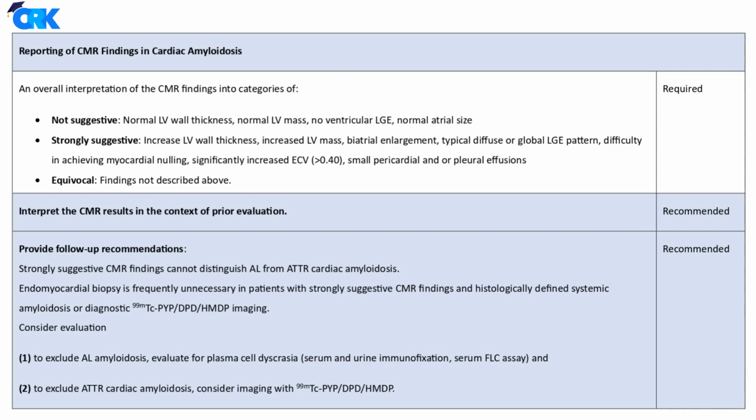Equivocal. This category is for studies that don't clearly fit into either of the above. Findings may be borderline, mixed, or atypical. In such cases, additional testing or correlation with clinical and laboratory findings is essential.